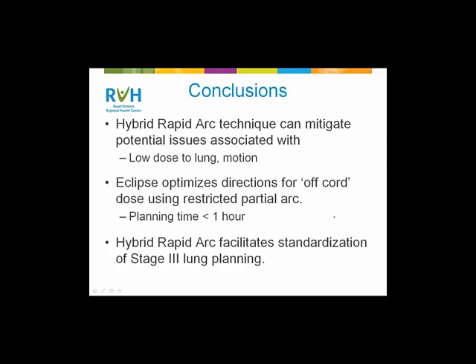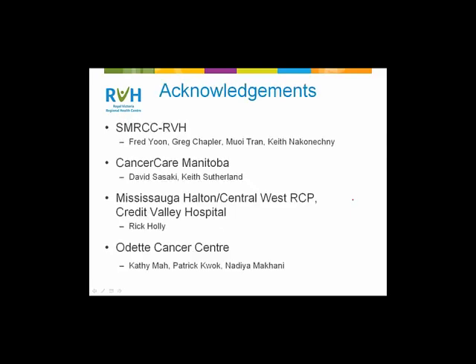I don't think we have a standard that's fully in place yet for that low dose. There's certainly nothing in QUANTEC, for example, regarding V5. But I suspect that as more of this data becomes available, there will be consensus published. But I expect them to be in the range of V5 less than 60%.